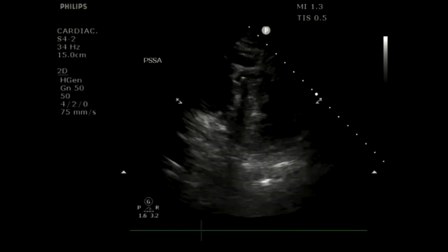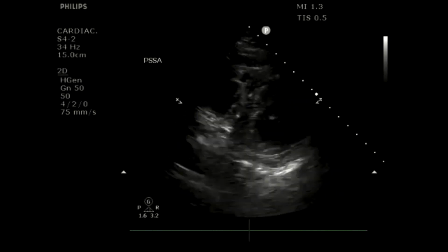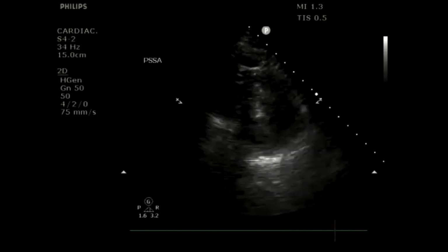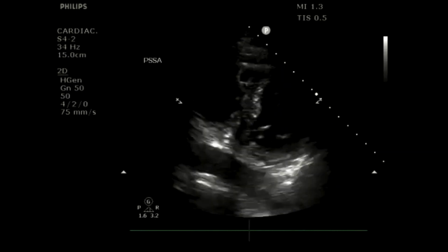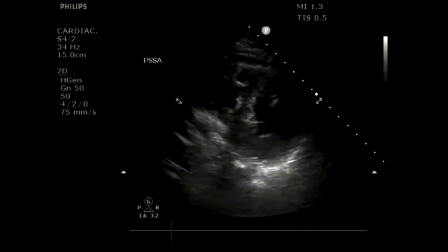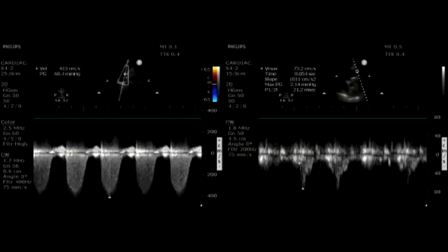And this one, I kind of knew what was going on before I scanned the patient. But if you were scanning this patient de novo and you had a right story, like, something's not quite right here, especially if their previous echo was normal, to get the ball rolling. But then I did these measurements, right? And so this is what we're going to talk about.